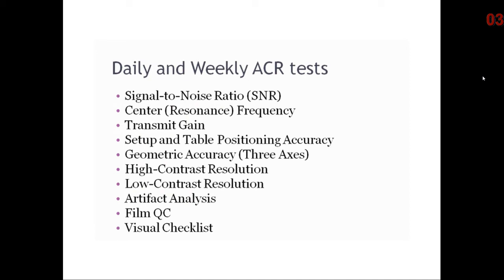There are several different tests that should be run daily and weekly using your daily phantom, that's usually supplied by the vendor, and the ACR phantom. The signal-to-noise ratio and center frequency tests should be done on a daily basis.